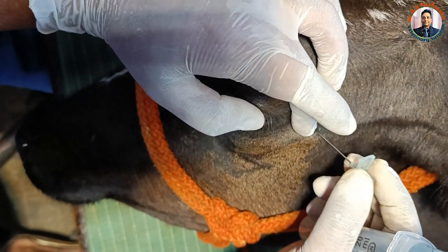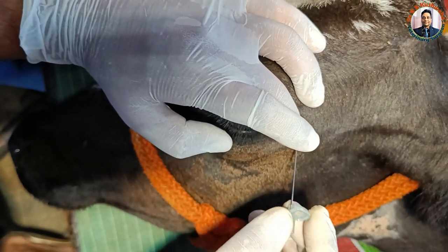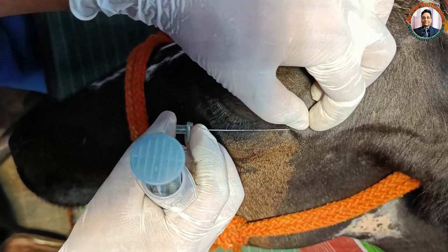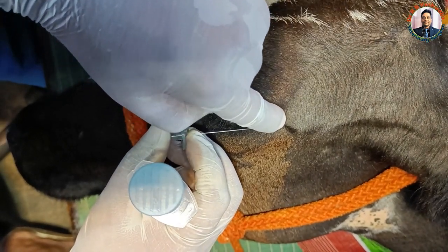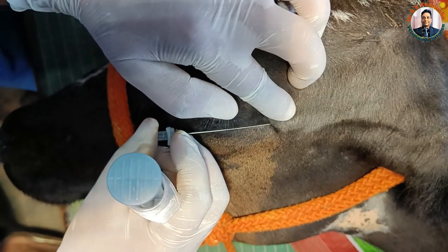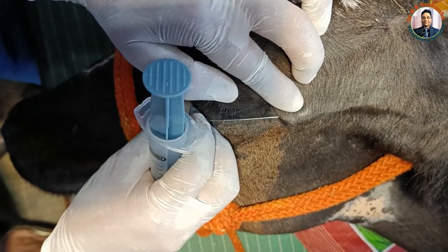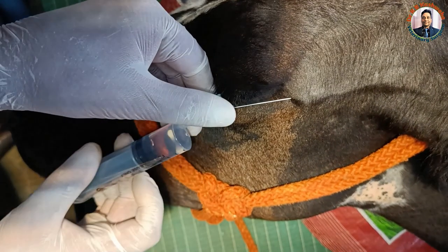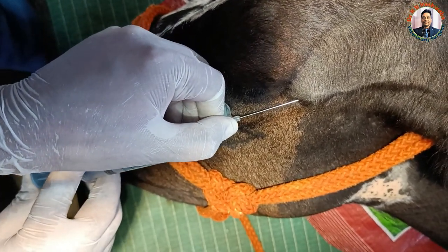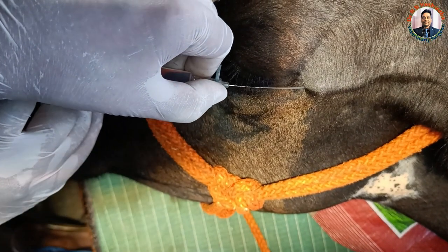From the same point, without removing the needle, once the tip of the needle is just beneath the skin, turn towards the zygomatic arch and inject in a fan shape for the auriculopalpebral nerve block.